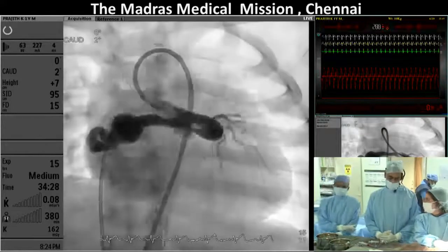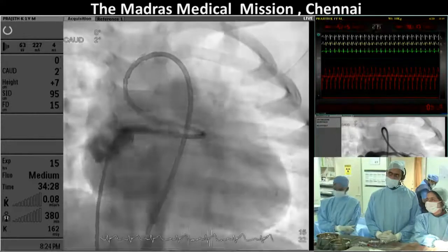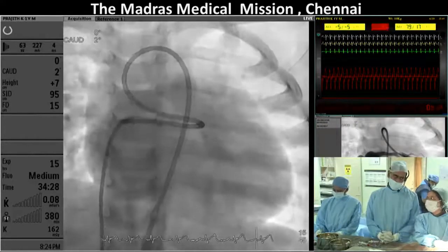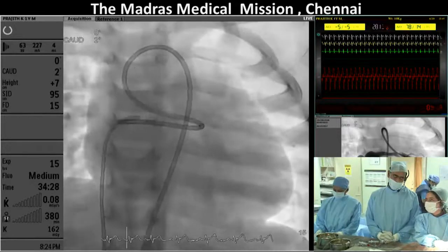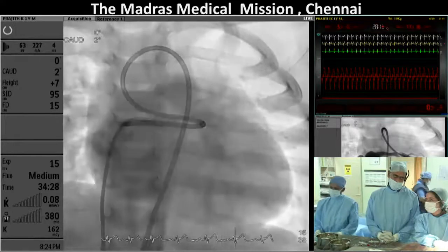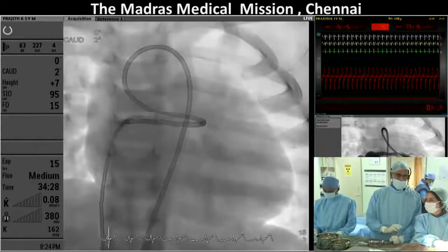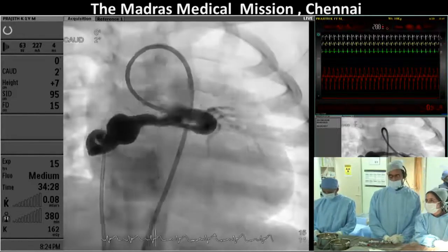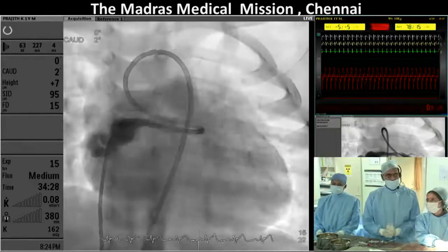One thing, we do not see the exit points quite. Do you have another projection where we can see where exactly it opens, or the two openings? And if you can pass another wire while you have your catheter in the smaller hole, maybe you can track another wire and show us the larger hole. But that's only relevant if you're going to close the right atrial end through the biggest. The two ends. First of all, if you're going to fill the aneurysm, it doesn't matter.